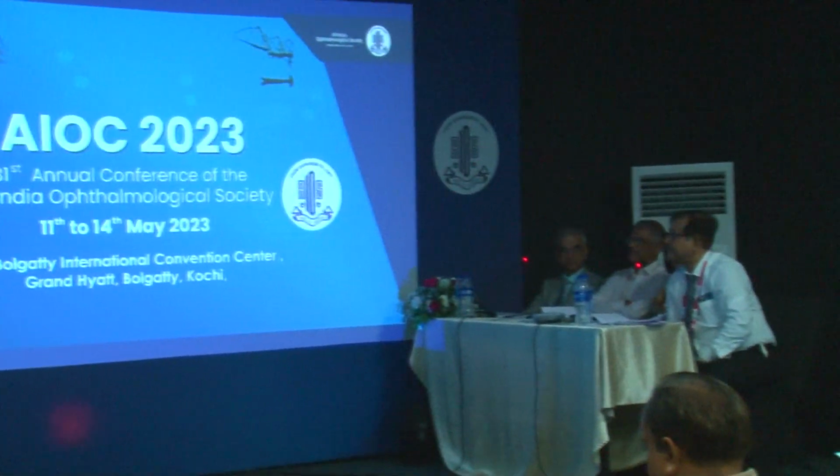Doctor, but were the lenses PMMA? Yes, non-foldable PMMA lenses. So you're not putting any stitch, you're just pulling it out after you've placed it in the sulcus? Yes, yes, this is just another safety measure for the novice, as you said. Right, we understand.